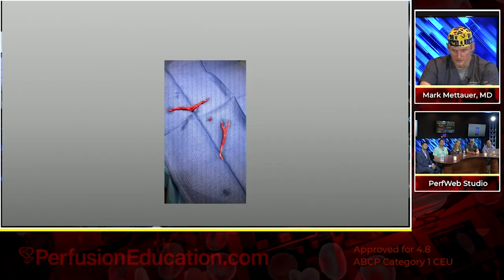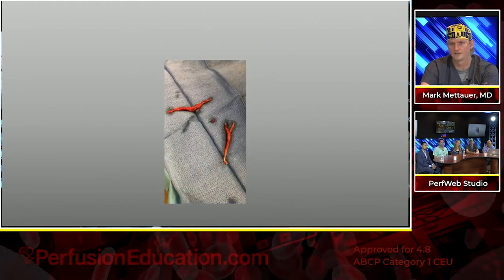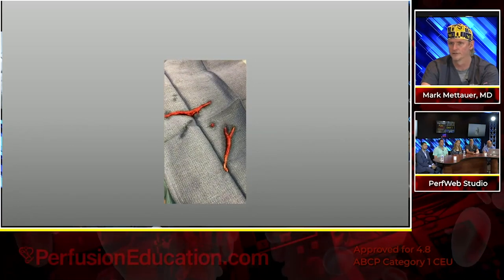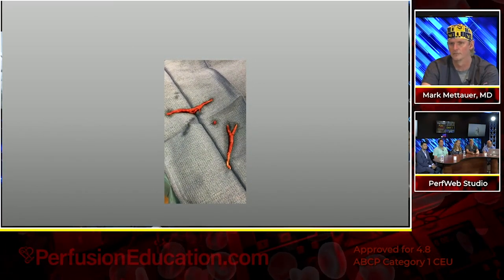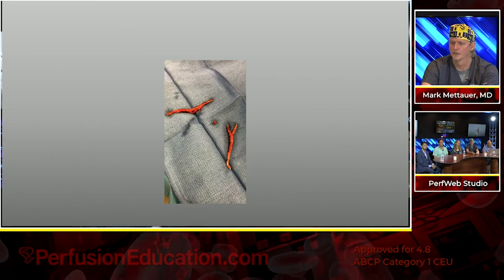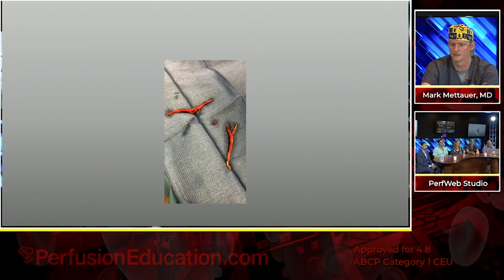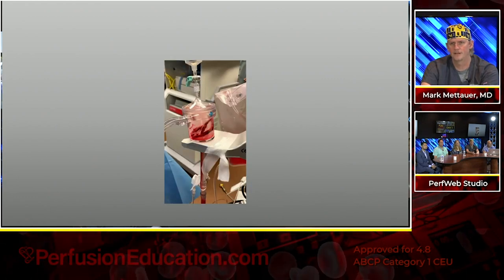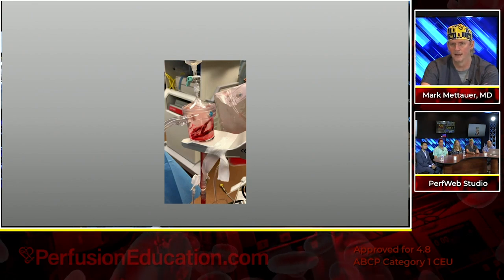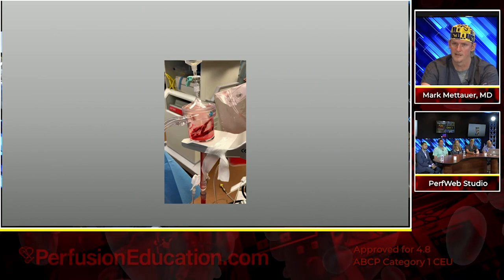So this is a specimen removed. Two large pieces, you can see there, are casts of, I mean, not of the iliofemoral system, but of the catheter itself, with some component of probably an azygos vein or tertiary or secondary branch off of the superior vena cava. And then the filter itself, after being flushed, with the specimens inside.